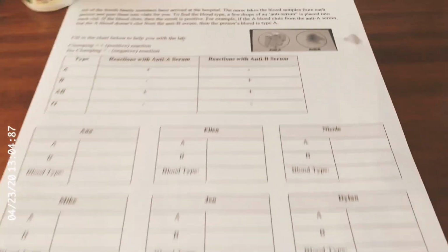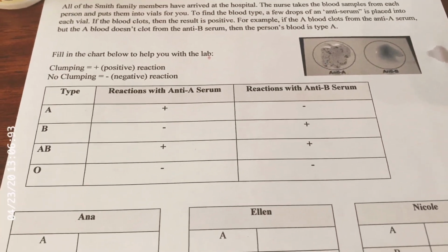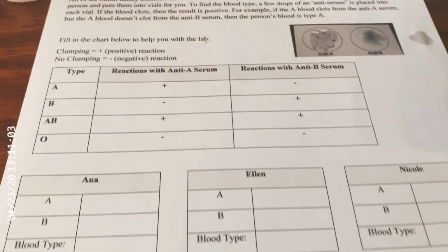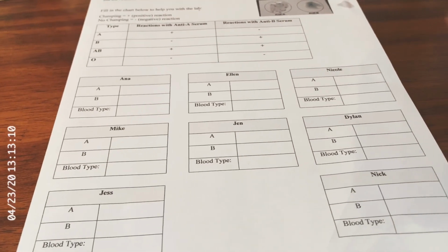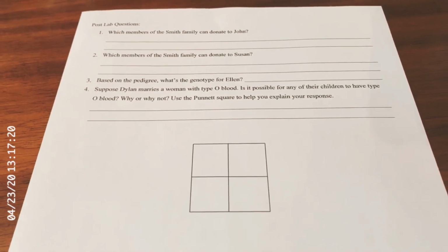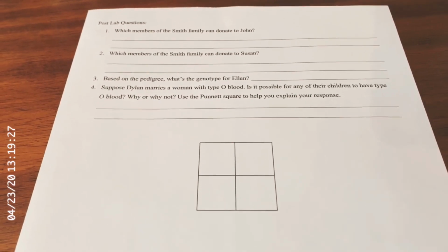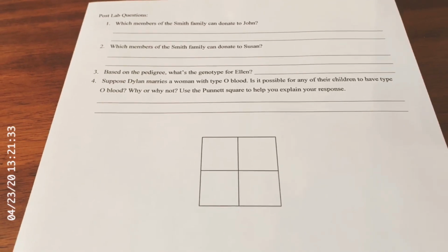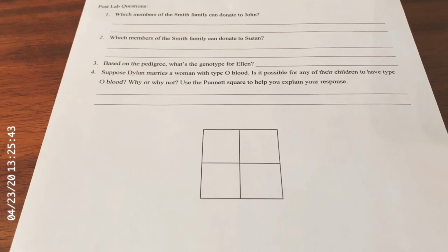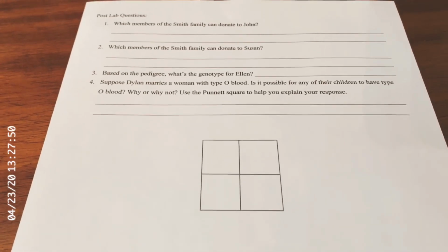Remember, if they're positive, you can go ahead and follow this chart and figure out whose blood type is which. If they're both negatives, they are O. Remember that one, I know sometimes that gets a little bit confusing. Last thing you gotta do is answer the post-lab questions. Which members of the Smith family can donate to John? Which members can donate to Susan? Based on the pedigree, what's the genotype for Ellen? Remember, genotype with blood typing uses the I's.